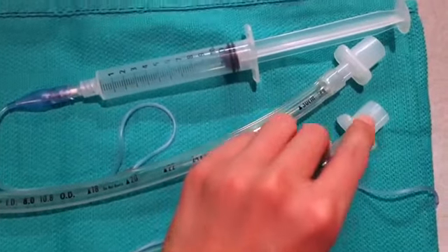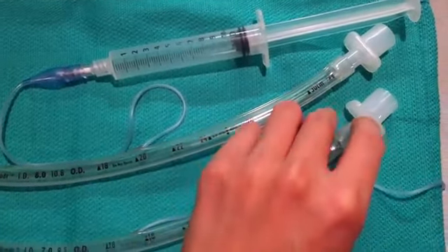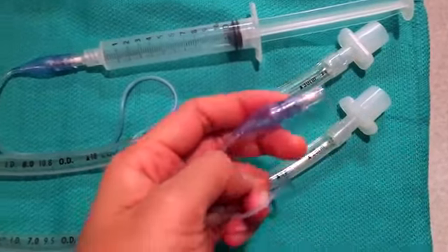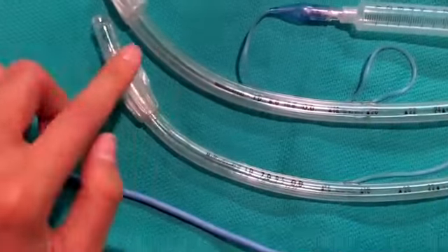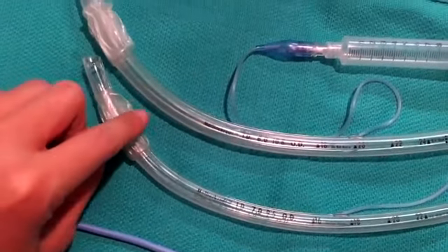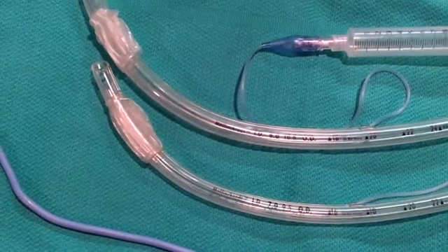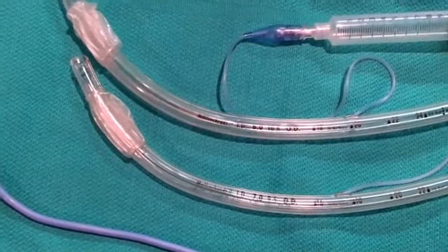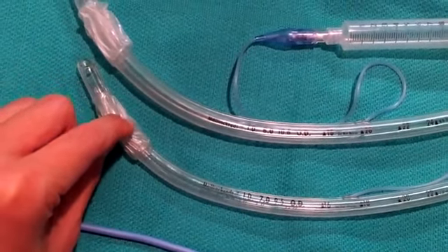There's a cap here. This is what attaches to the ambu bag or to the vent. After you intubate, this is a cuff. You can put air in it, and it will inflate. It allows you to secure the airway and helps block anything going down the airway into the lungs, like secretions.